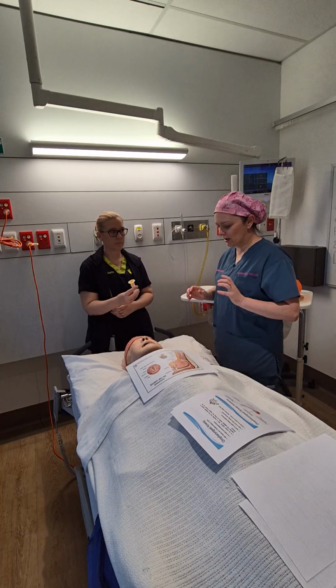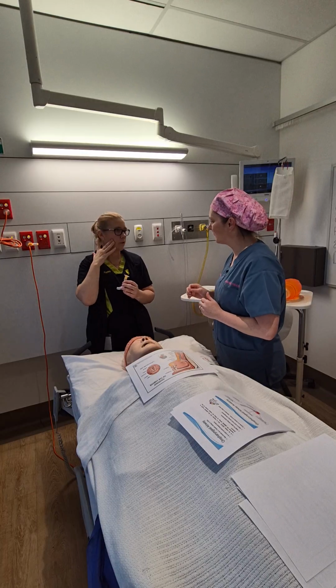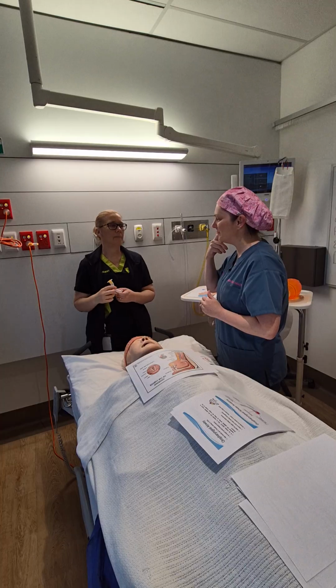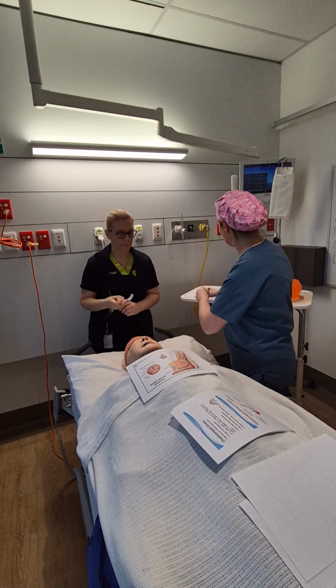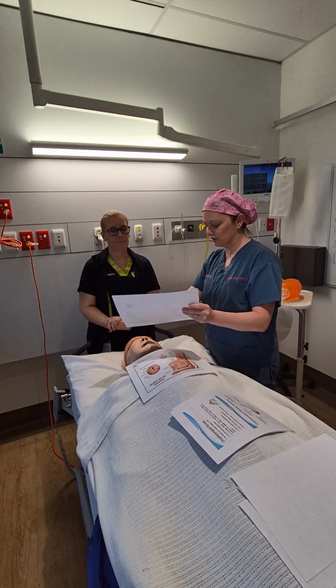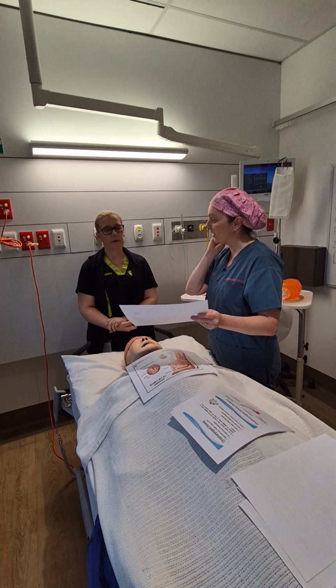Do you know how to measure for an oropharyngeal? I think it goes from here to here, I believe. So from the corner of your lip, and then we go... Oh, I've got a picture. Sorry. So we go from the corner of the lips, across the cheek, and then to the angle of the mandible. So we go from here to the hard part of your mandible.